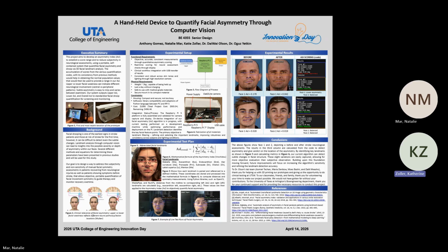And then right now our Python code runs on 3 major libraries: OpenCV, MediaPipe, and NumPy. Each of them kind of targets a different thing. Like NumPy is what calculates our formula. MediaPipe is what we use to identify those landmarks. And then figure 7 shows how our code is running. This is really early on in how our code ran.